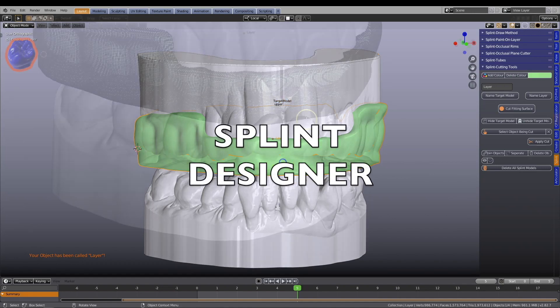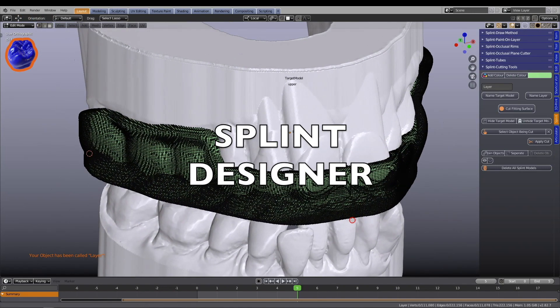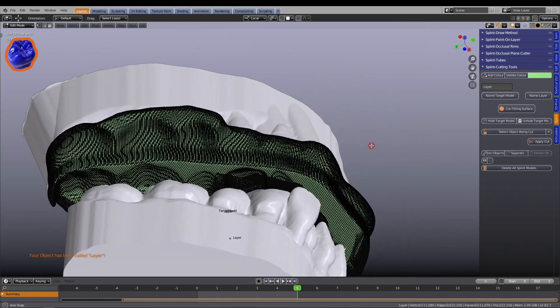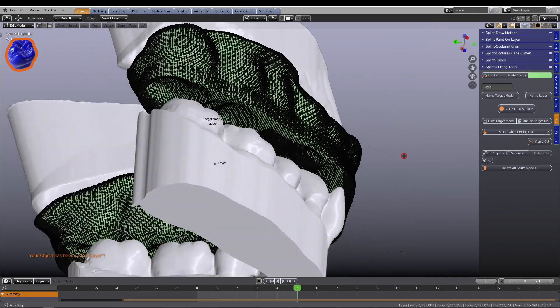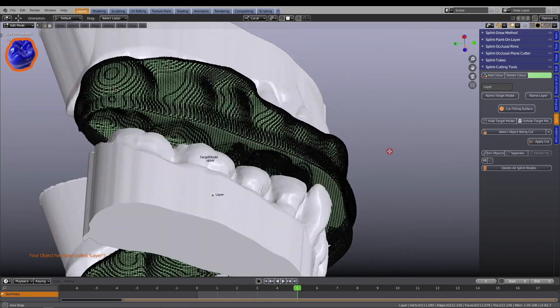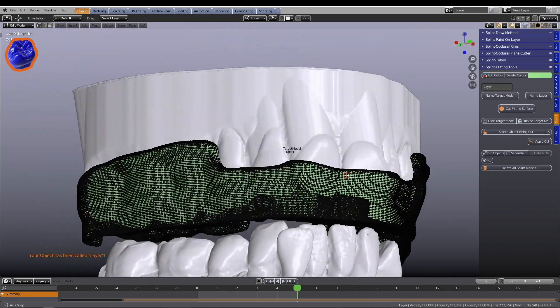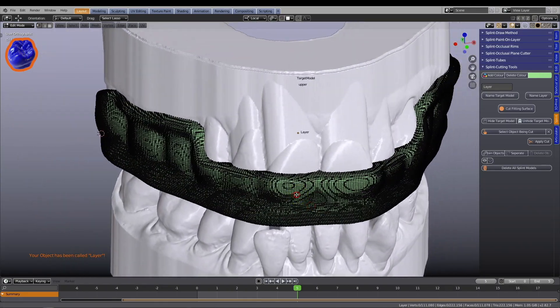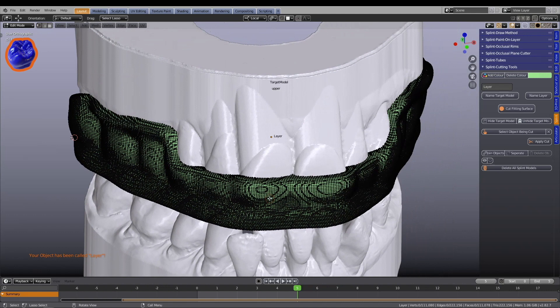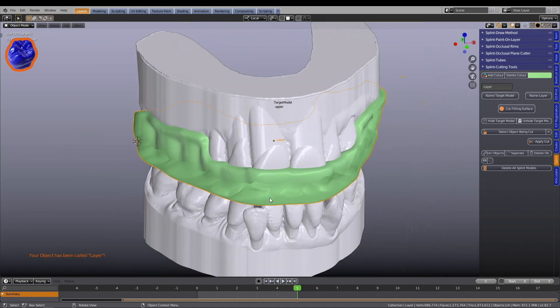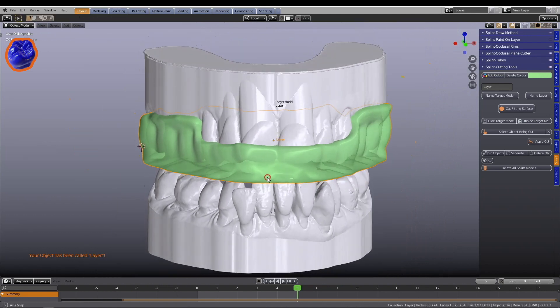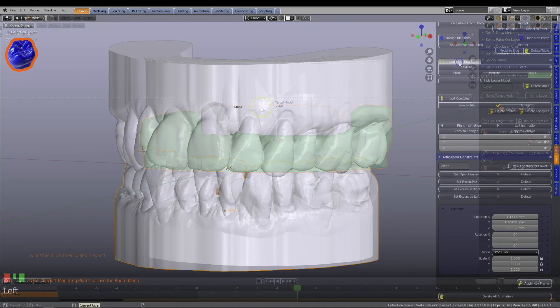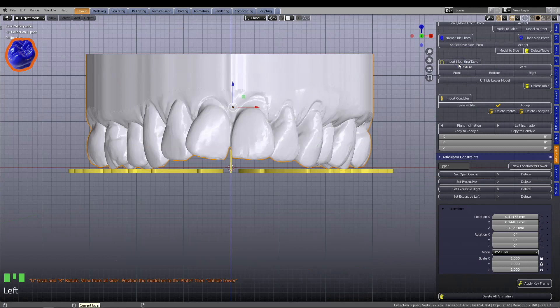Blender for Dental is powered by the free and open-source Blender software program. With the Splint Designer, you can design your own occlusal splints for 3D printing or CNC milling.